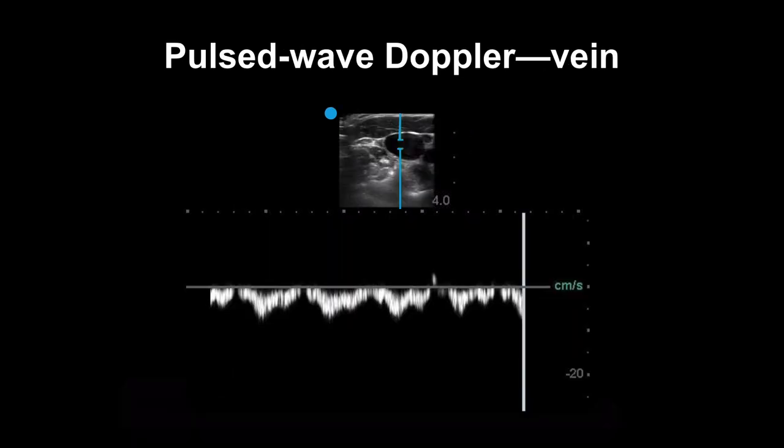Here's an example of pulse wave Doppler in a vein. This is lower velocity than the artery and has a more undulating baseline than the spikes that you saw associated with pulse.